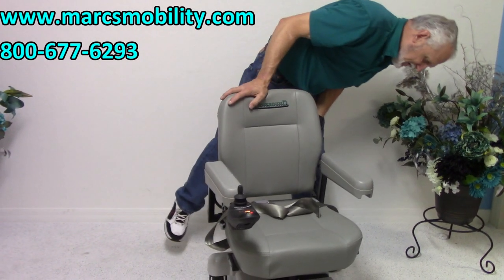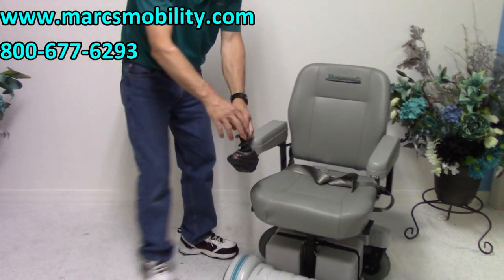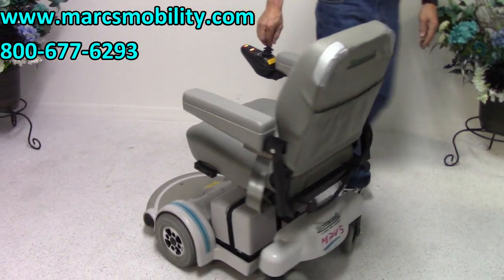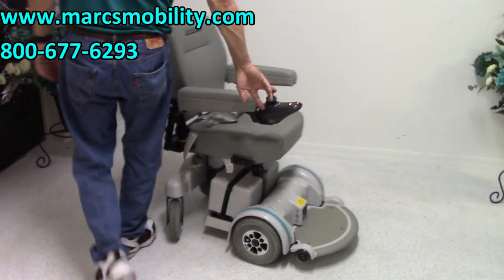This is the MPV5 — it's got a real nice turning radius. Let me bring it over here so you can see how it turns. When you turn in a circle, it turns on its own self. You can see how it turns.